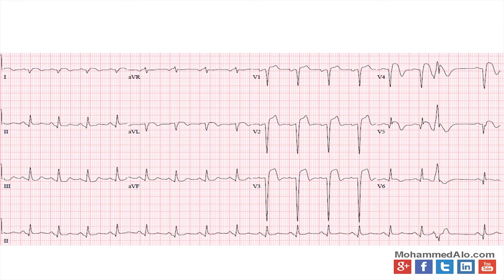You see V1 through V5 are all elevated. Those reciprocate to your inferior leads. 2, 3 and AVF are not depressed. Probably an acute MI, even without the reciprocal changes. Of course, if this guy's had this for a while, then it's not an issue. But if you look at V4, there is no R wave whatsoever in V4. Highly goes with an acute MI.